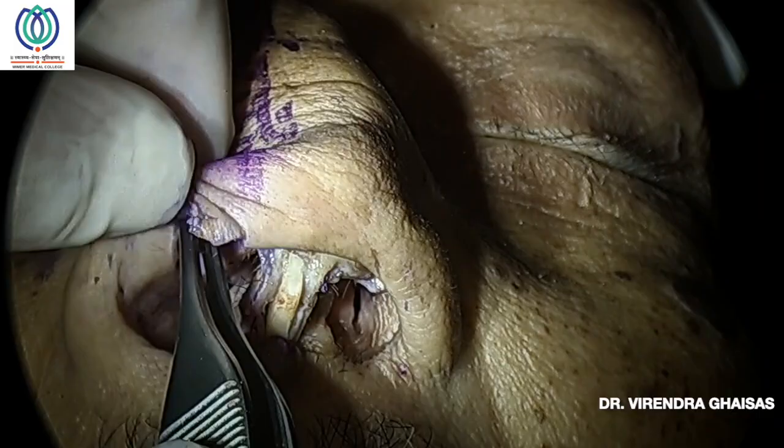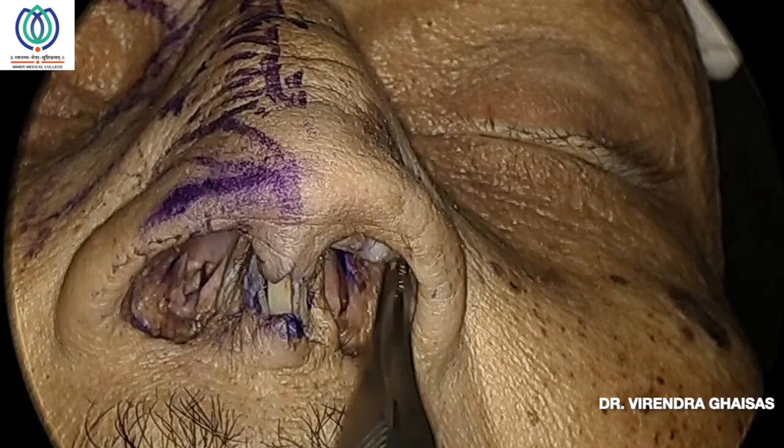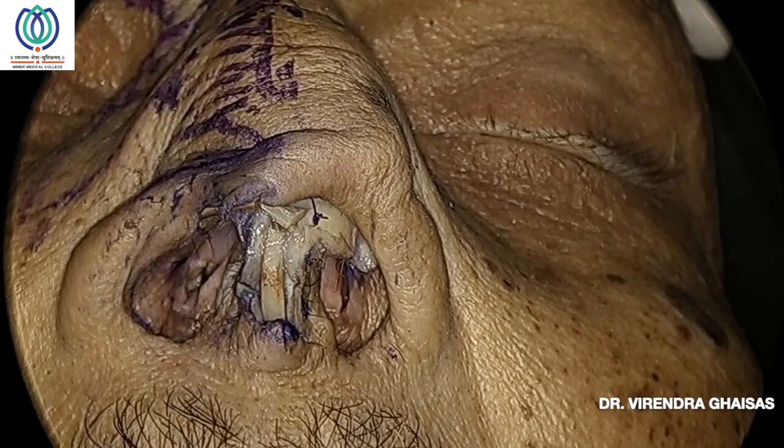Either the medial end is floating, or you fix the medial part of the rim graft to the dorsal onlay graft. If the skin is thick, then it's better to fix the rim graft, as the tension of the skin can pull these rim grafts.